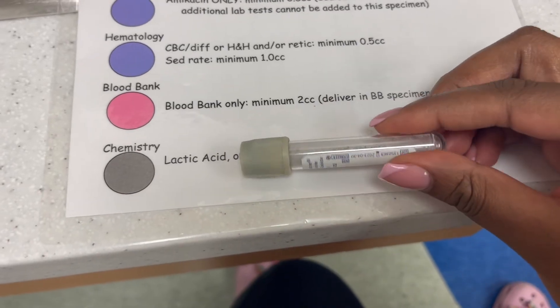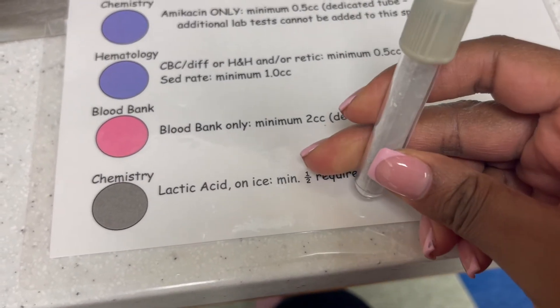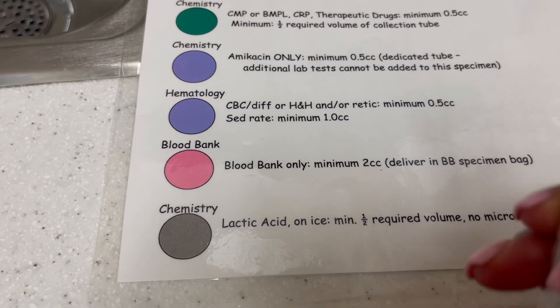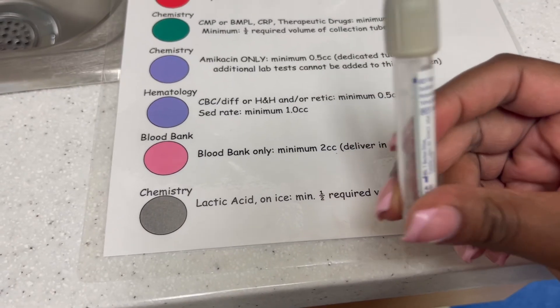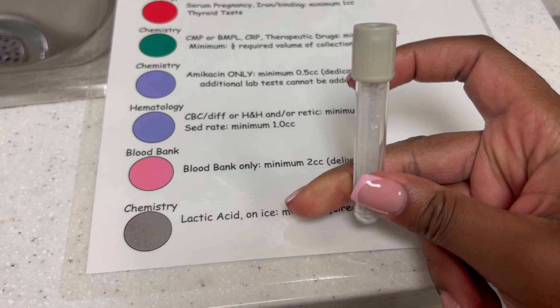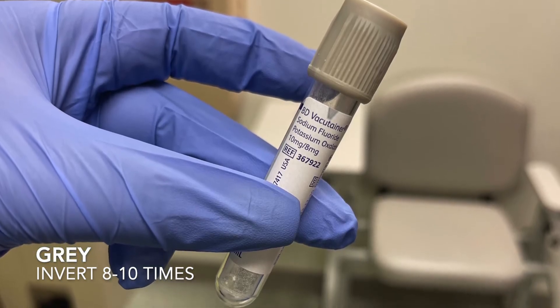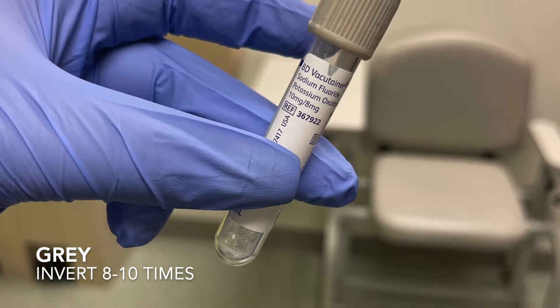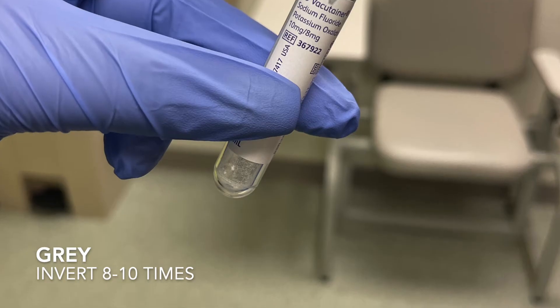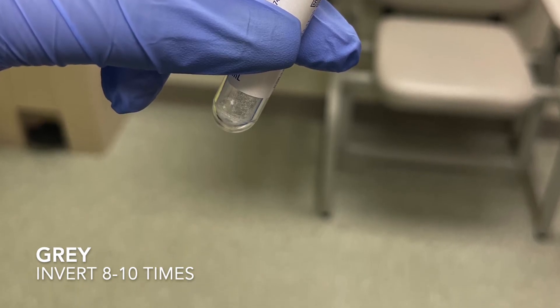Lastly, we have lactic acid to check for infections. When collecting this, you cannot have a tourniquet on during collection. You can tie the tourniquet on to find the vein and stick the needle in, but once blood starts flowing, release it. You also have to put this tube on ice, so it's best to get the ice before you stick so you can place it in ice immediately after collection. Do not have a tourniquet on while collecting this specimen — if you do, results will be extremely high and will raise concern for the doctor. A tourniquet should only be on to help locate the vein.